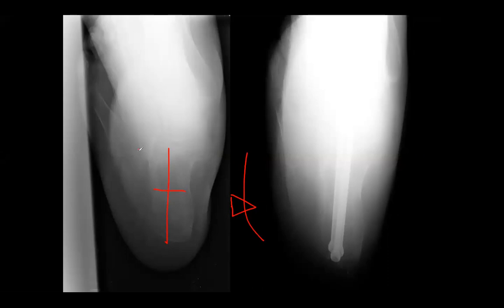If we look above it, we can trace out the fibula here. And we see the talus kind of coming up here. And here's your medial mal. So if we're going to bisect the talus, it's going to come up like this. And the tibia is kind of up like that. So where do we think our deformity is at this point?